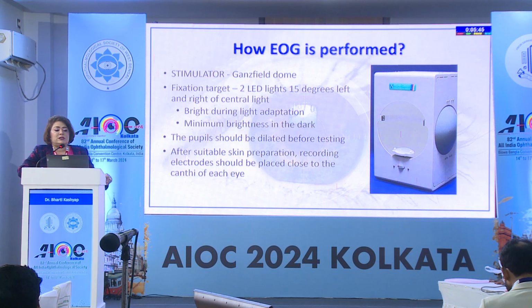The Ganzfeld dome is the stimulator. The fixation target is 2 LED lights, 15 degrees left and right of the central light. It is bright during light adaptation and minimal brightness in the dark.